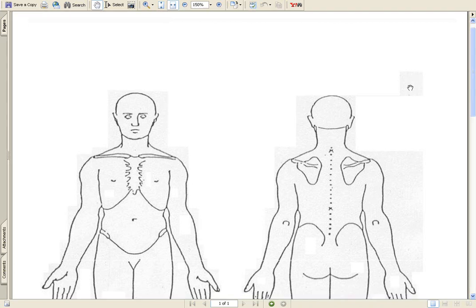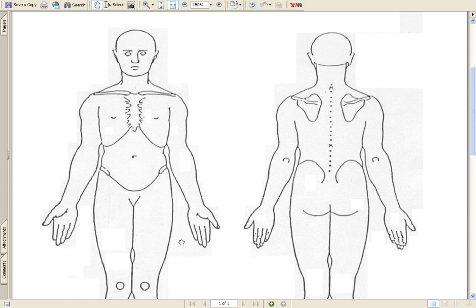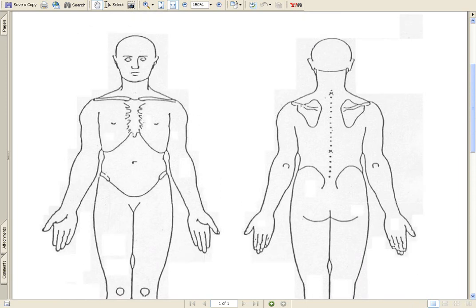But you would print this document out and take it to your clinician, and they would specifically tell you where they want the electrodes. Maybe they want two electrodes here and here, or wherever they want. That way you can be specific about exactly where these electrodes are going to be placed. And if you've done muscle stimulation, if you're the claimant, you've probably had it done at the therapy clinic and you might be familiar, but it's always good to print this out and get specific information on exactly where the pad placements are.